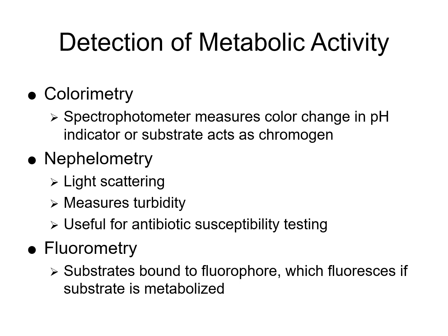Nephelometry, you're looking for the light scatter, you're measuring the turbidity. This is going to be useful for your antibiotic susceptibility testing, where you're looking for that turbidity or the presence of that growth of that organism in that specimen. So if there's enough antibiotic there to kill it, then it shouldn't grow. However, if that organism is resistant, then you're going to have the turbidity within that solution.